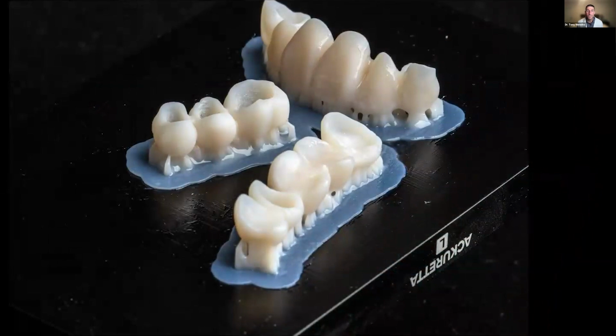So what I've done here is I've printed all these restorations. I can put them in Joel's mouth. He can have them while he's getting that lower arch of dentistry done, so we can kind of stage this treatment. The nice thing is, if something breaks, if something debonds, things happen in the course of a year or so while he's getting all this other treatment done, all I have to do is print out another one. So this is a full arch of essentially bridges. If one of those bridges breaks, it's $5, $7 for me to print another one and have it ready to go, because I already have the digital design.